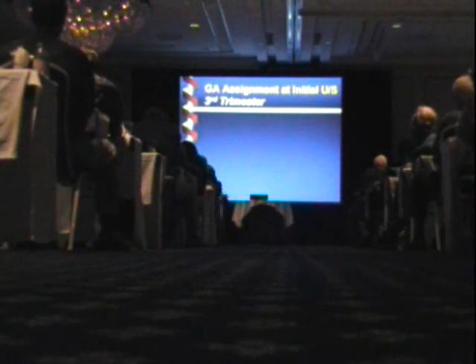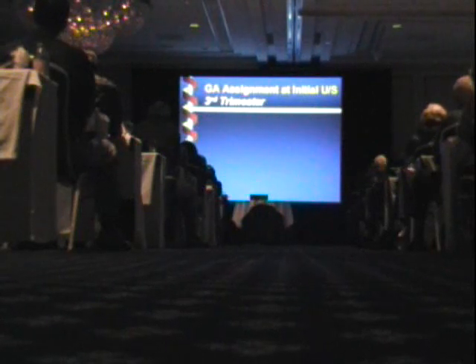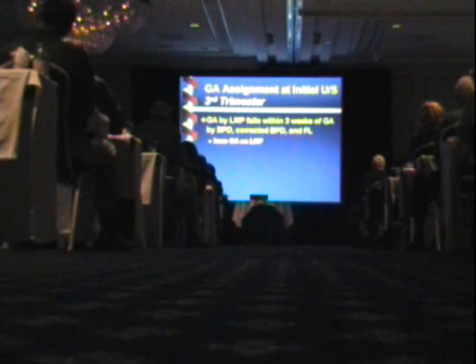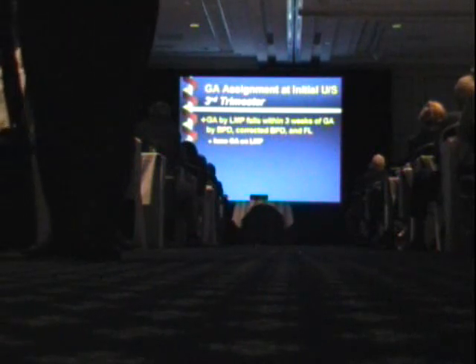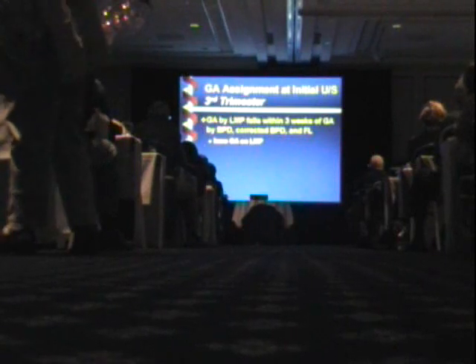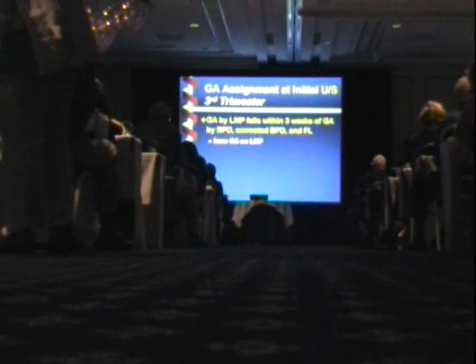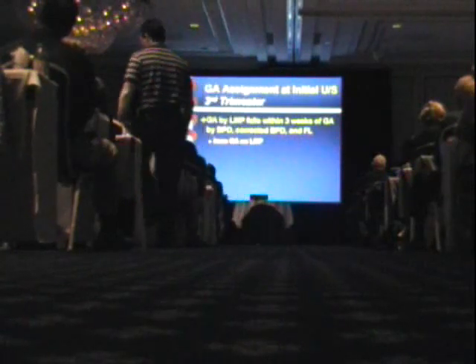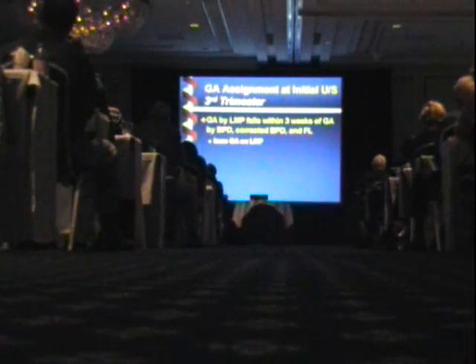These days, I must say, we see fewer and fewer pregnancies whose initial ultrasound is in the third trimester. Most women these days have ultrasounds earlier in their pregnancy, in which case this won't apply. What I'm going to show you on this slide only applies if the initial ultrasound is in the third trimester. If the gestational age by the last menstrual period falls within 3 weeks of the age based on the measurements, we'll base the gestational age on the LMP as opposed to measurements. Measurements aren't very reliable in the third trimester.